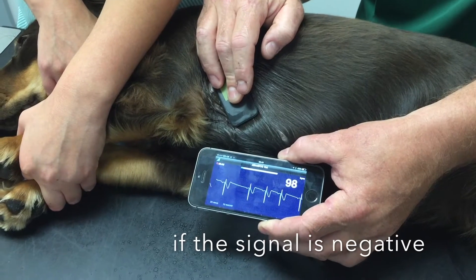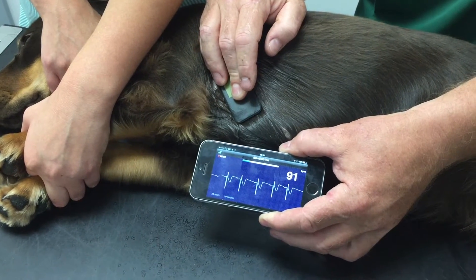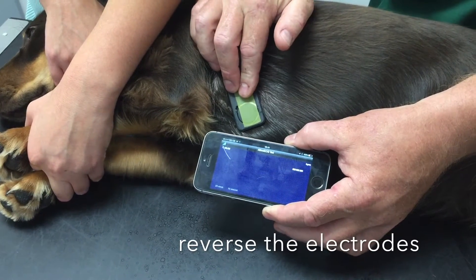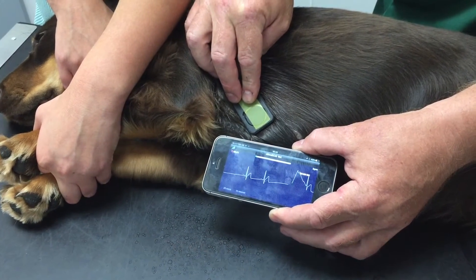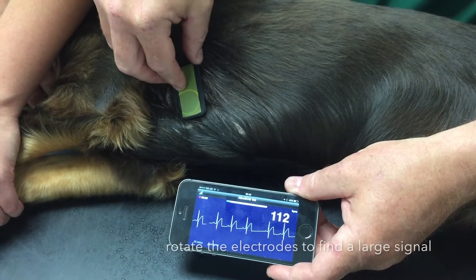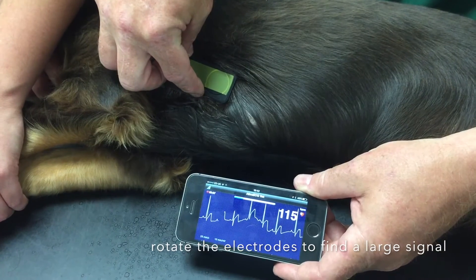The signal should be positive — i.e. upwards — in most animals. If not, as in this example, try rotating the electrodes the other way around. If the signal is small, try rotating the electrodes until a bigger signal is obtained.